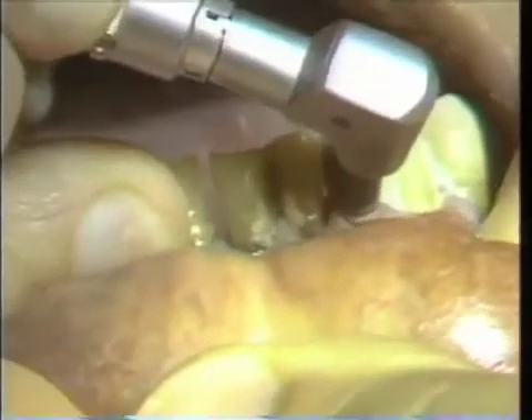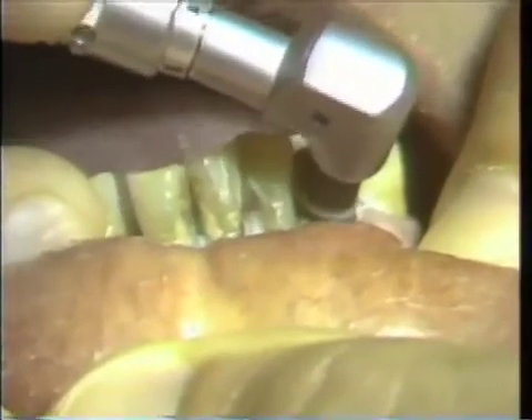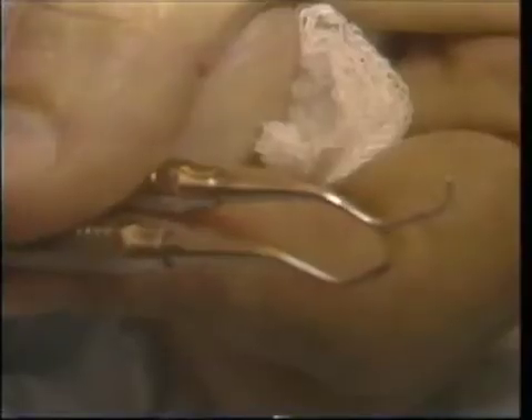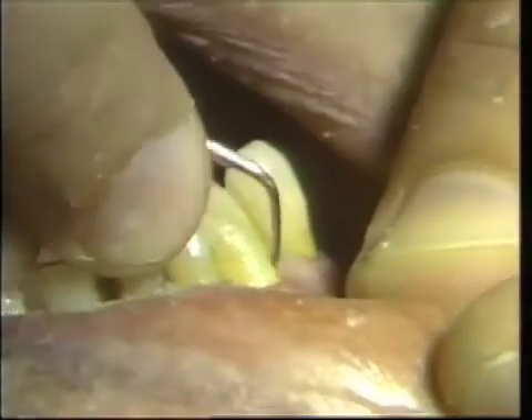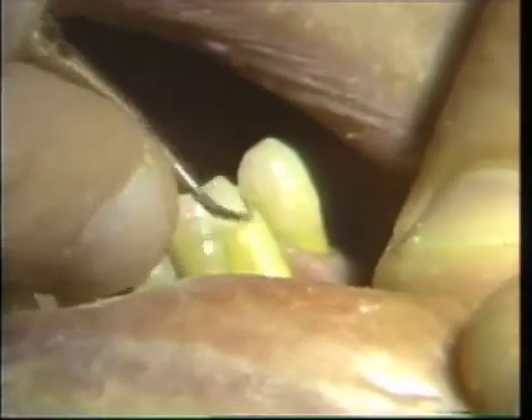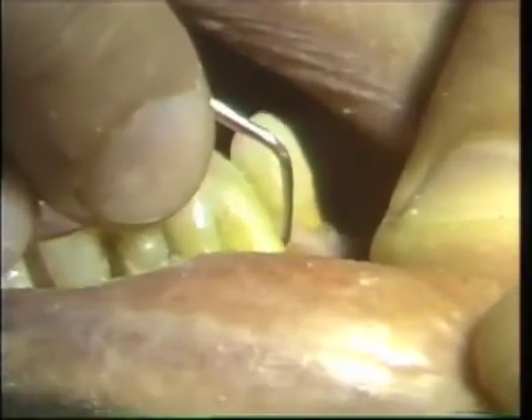A rubber cup polishing was given before the scaling. We used Gracey curettes number 3 and 4 for the subgingival calculus. On the first visit, we will concentrate on the left side — teeth numbers 21, 22, and 23.